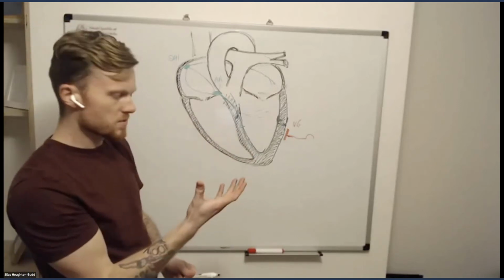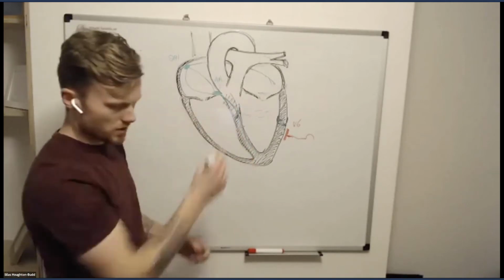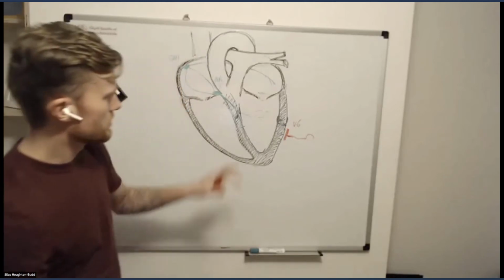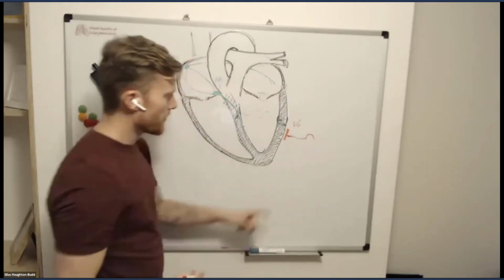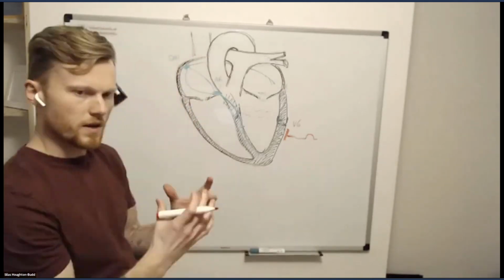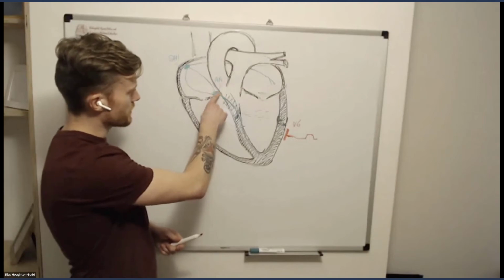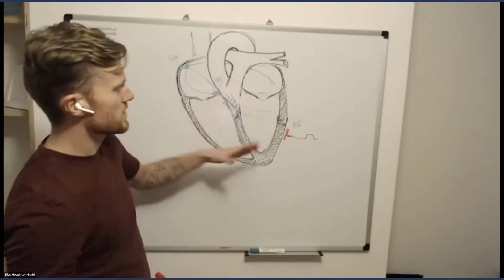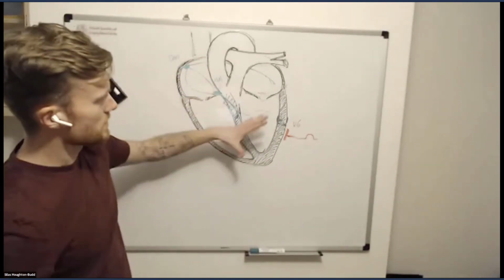And so what we see in terms of contraction of the heart is that this electricity, or let's have a look at the waveform actually, and then we'll talk about contraction. So if we go back to the waveform, we've discussed the P wave here. This pause, we get this pause of isoelectric line of no electrical activity at all. And that's when the electricity is traveling through the AV node, through the bundle of His and into the His-Purkinje system.